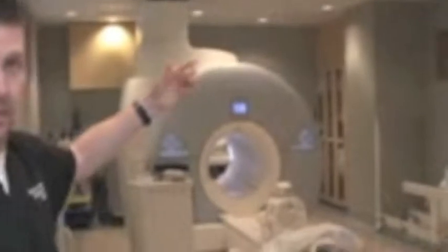If for some reason we had to shut the magnet down in a hurry, there's not a switch that you flip and then turn right back on. The magnet's always on. The only way you can shut the magnet down is to jettison the liquid helium, then power it down. If you want to power back up, it takes a good 3 days because you have to refill it with liquid helium, and you have to do it at a slow pace so you don't crack the magnet.